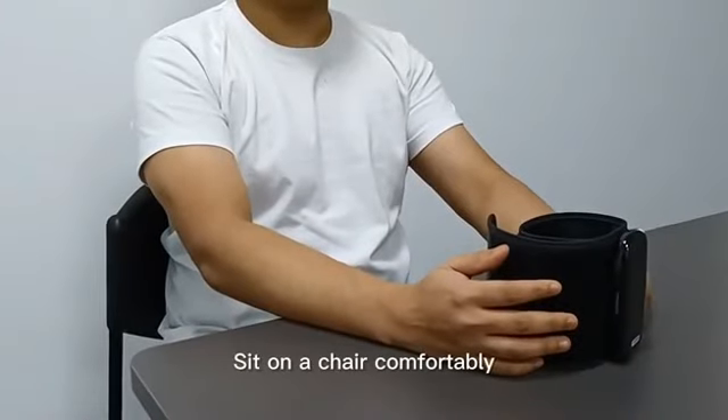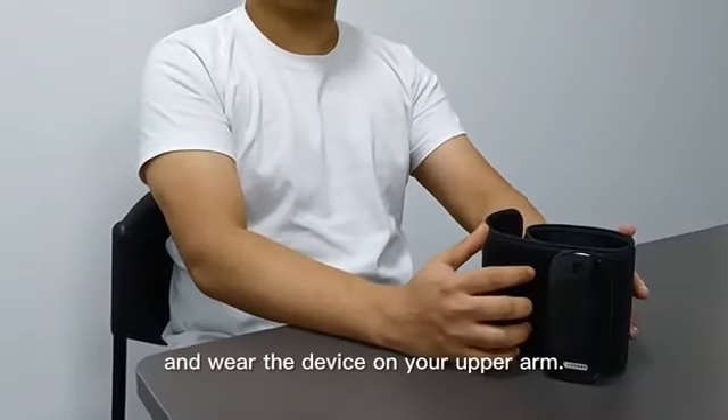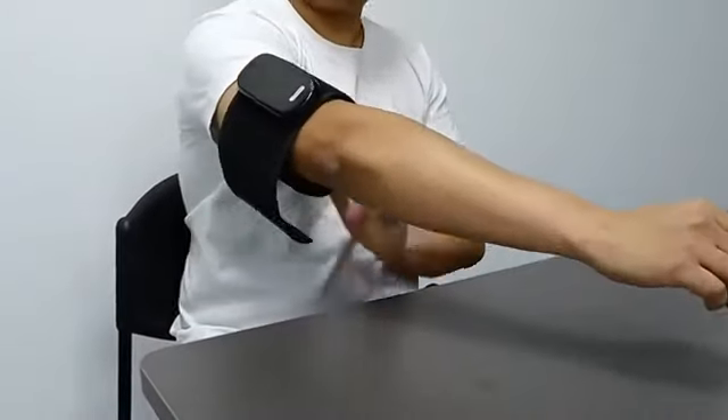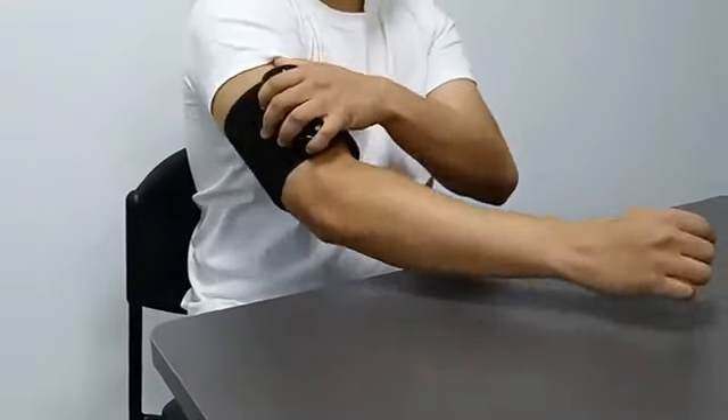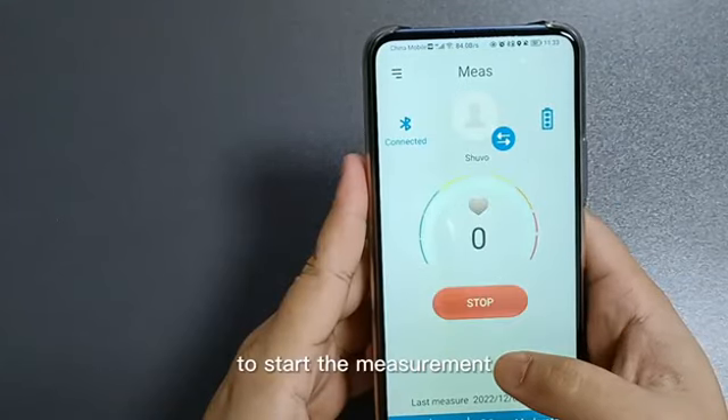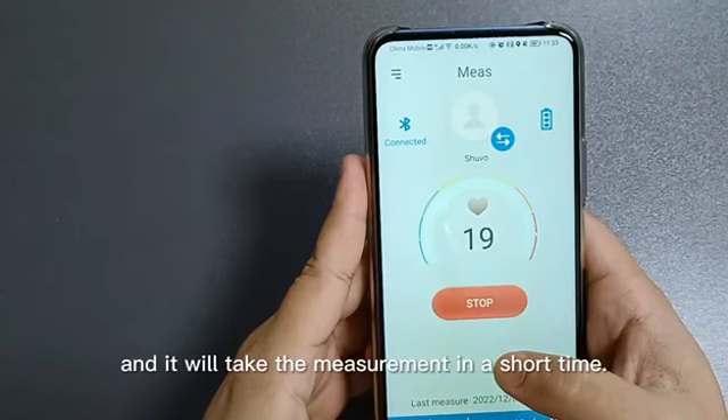Now, sit on a chair comfortably and wear the device on your upper arm. Press the start button on the app to start the measurement and it will take the measurement in a short time.